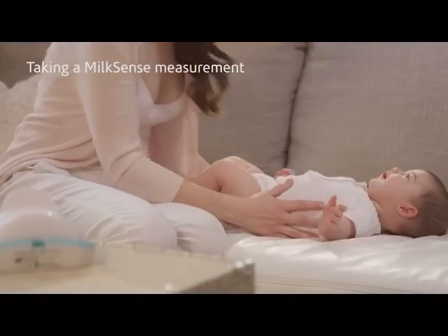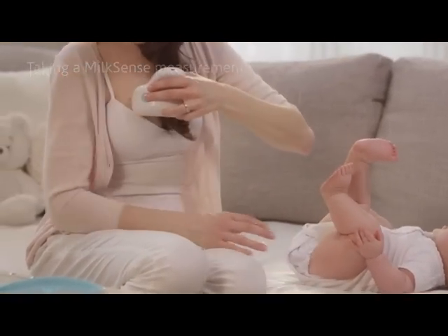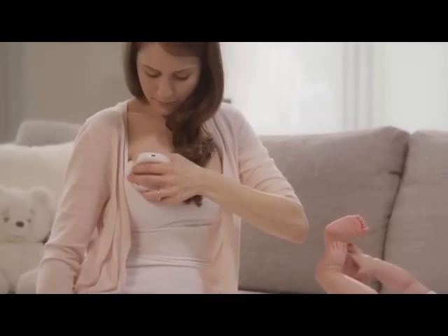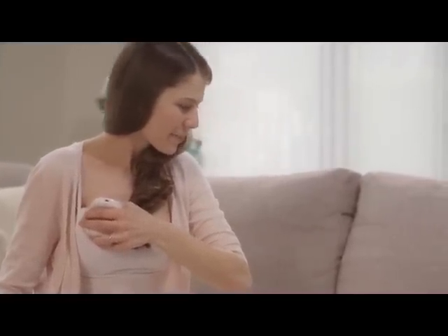Measurements with MilkSense should be taken while sitting in a relaxed position. With the MilkSense monitor comfortably in the hand opposite to the breast you are measuring, use your third finger to press the left or right button to indicate the breast you are measuring.